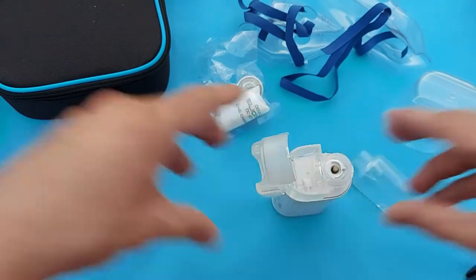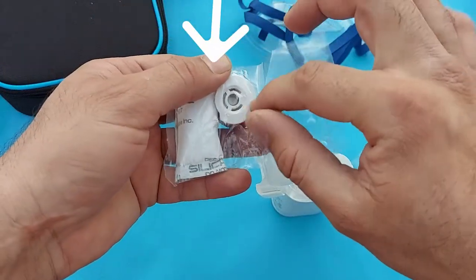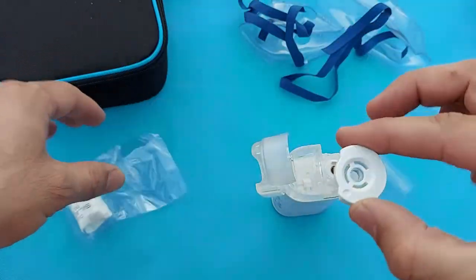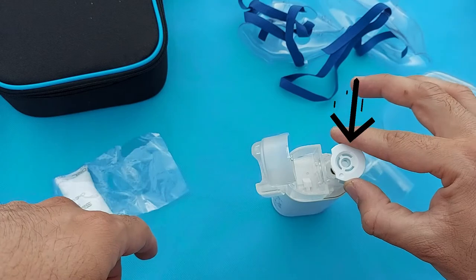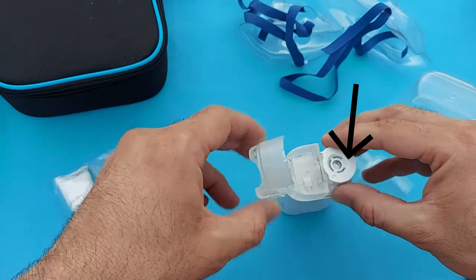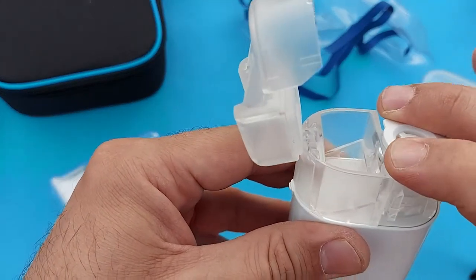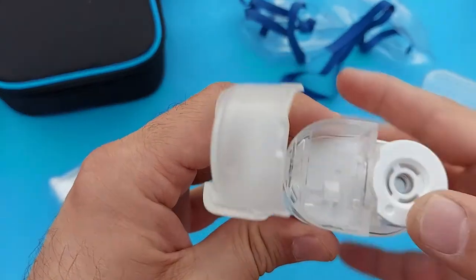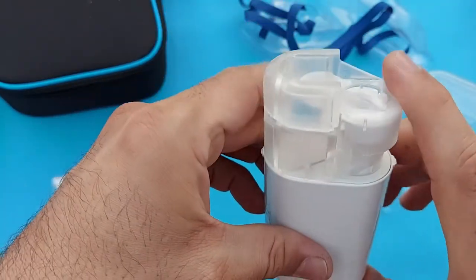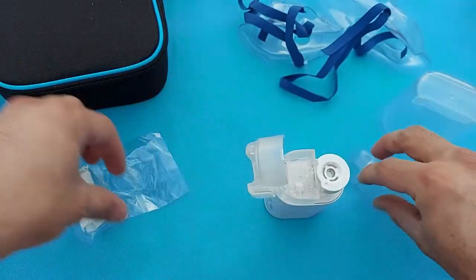First of all, this is the important step: you should see here — this is the mesh cap. This is very sensitive. You will hold it as shown in the video, put it here, and press gently to fix it — very gently, because this is very sensitive. You will not put your finger inside. Now close this cap and press it. Now we will put the medication, so let me open it again.